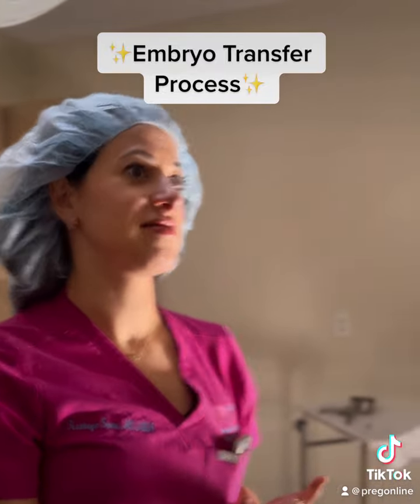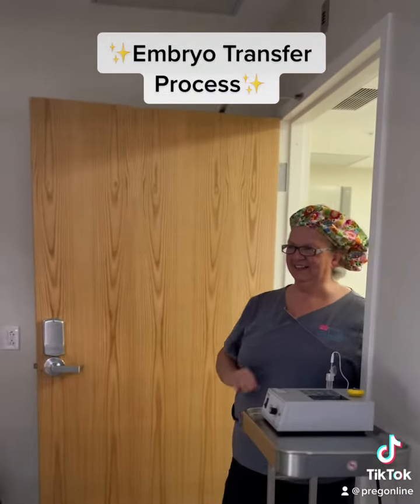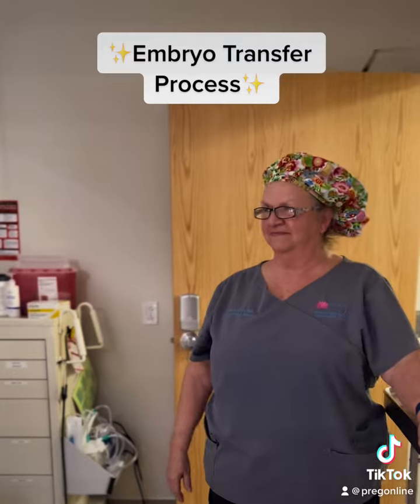Mary, say hey. Hi. Mary would then help by performing an ultrasound on the patient's belly so that we can see the uterus.